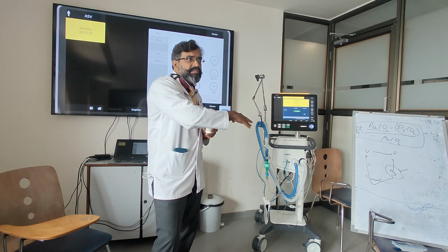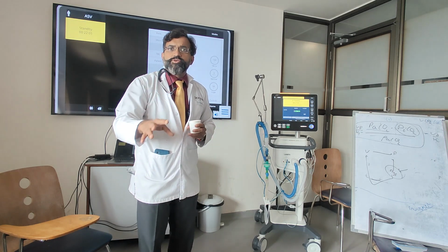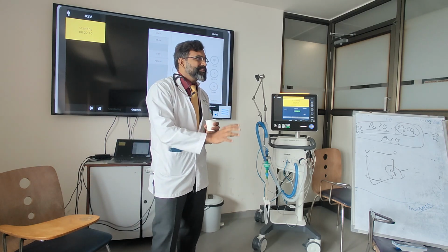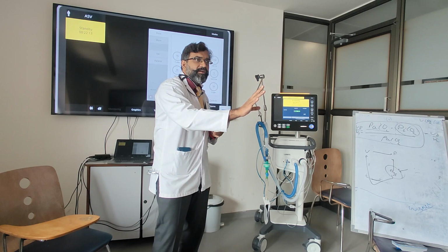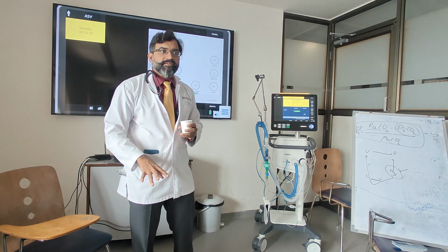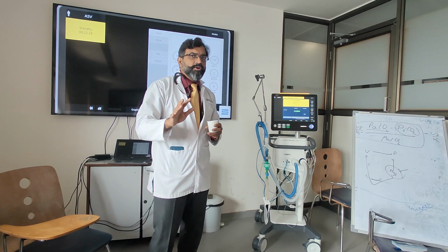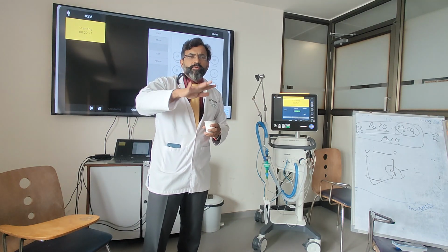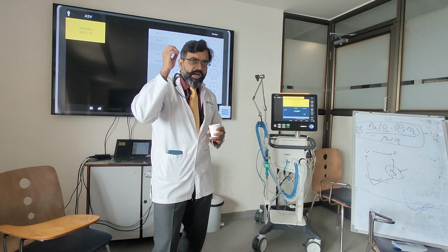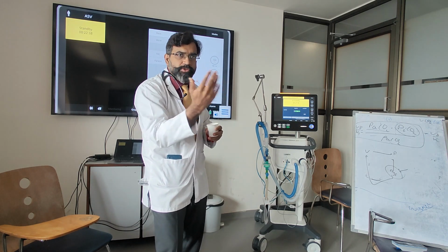If you have very sick patients, diabetic ketoacidosis is the worst case in which you put ASV. Worst case. They quickly move from extreme metabolism to extreme normal. In one day's time, they go from completely abnormal to completely normal. The ASV doesn't really recognize that, and it may potentially cause problems. So high metabolic rates and all these things, we probably want to avoid it. My take on this matter is, as we all learn, we first start with the conventional mode. When we see the patient getting better, we move to ASV. That will reduce our frequency of going to the patient.